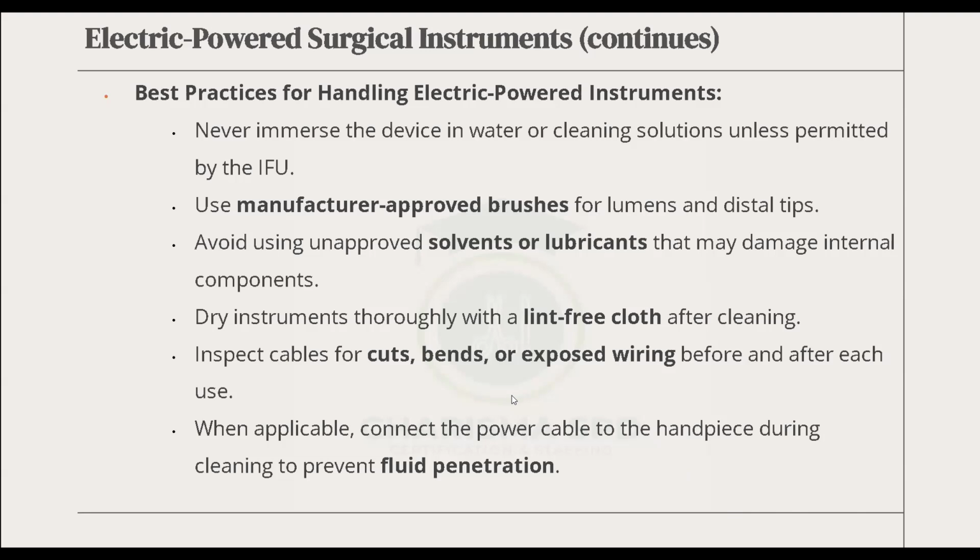Or sometimes when the piece that is washed still has moisture, you want to dry it before you put it together. The towel you might use might have lint. So we try to use lint-free towels to clean them so that we don't leave lint behind. Lint was one of the infectious pieces that were getting patients back to the hospital.